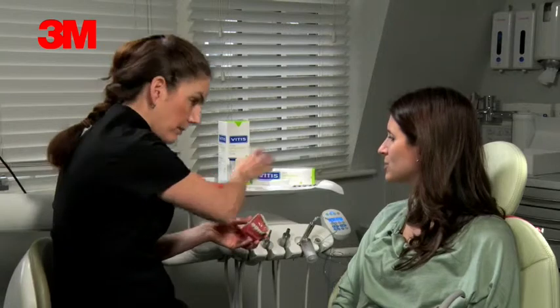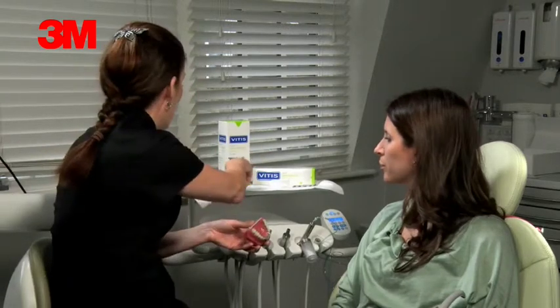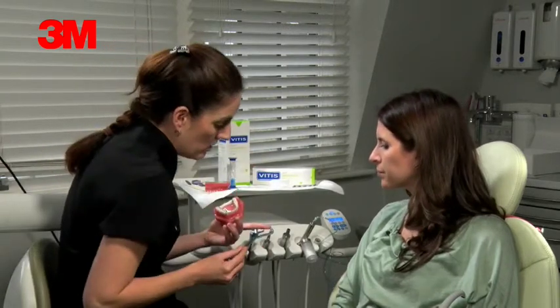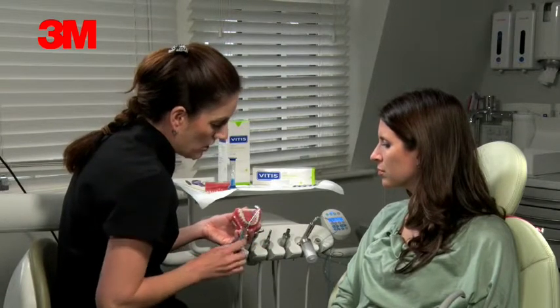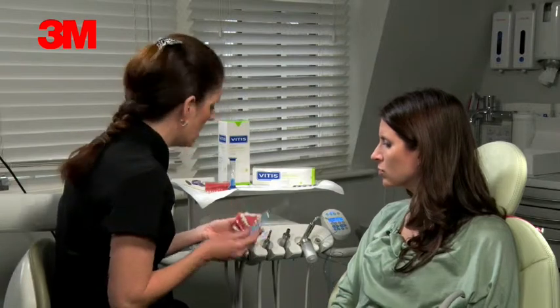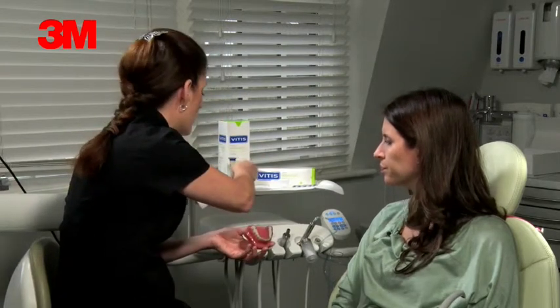And that all comes in the pack. You have got a single-toothed toothbrush here as well — if you want to get a bit further back and you find the others a bit awkward, it's a bit easier for you to use. Just whatever you prefer, really.